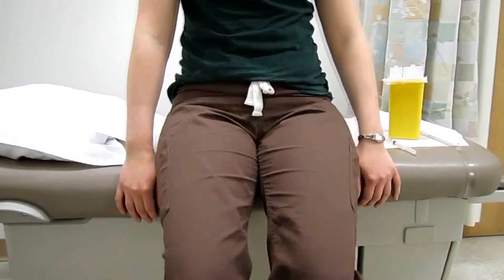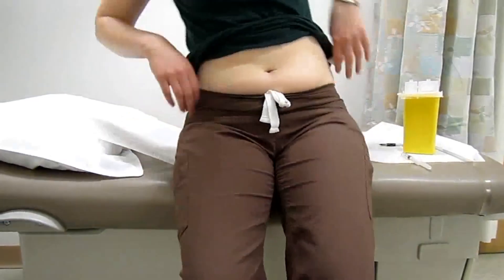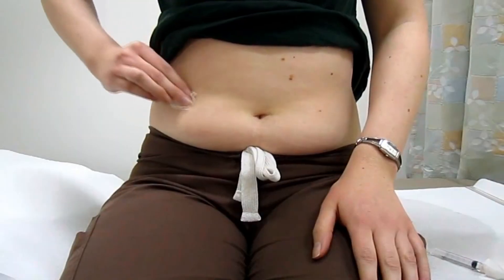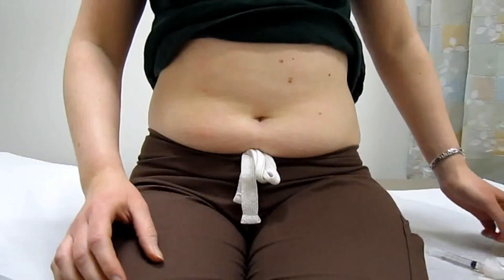Today we're going to be demonstrating how to inject into your right upper quadrant. Now we're going to be preparing our site. We're going to take our alcohol swab, and much like preparing your vial, we're going to start from the inside and clean in a circular motion outwards.